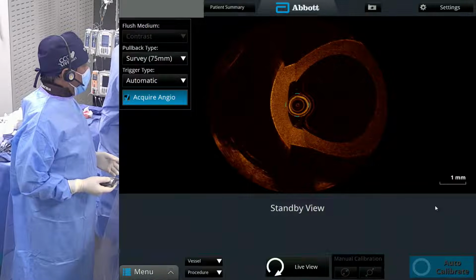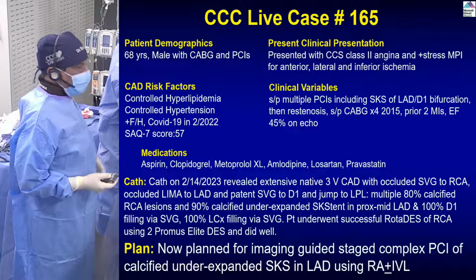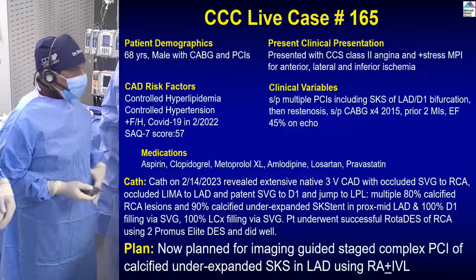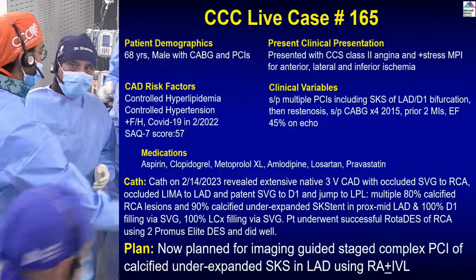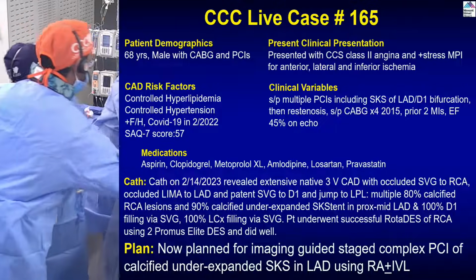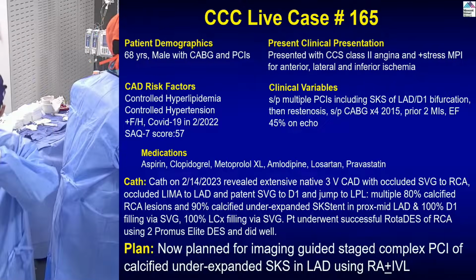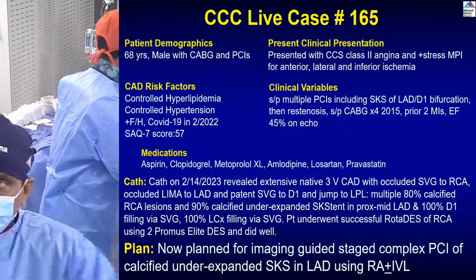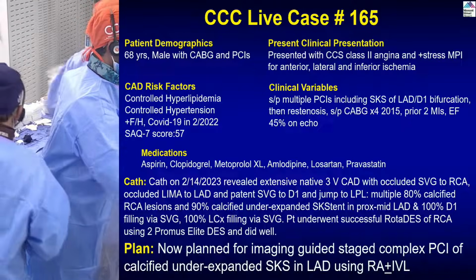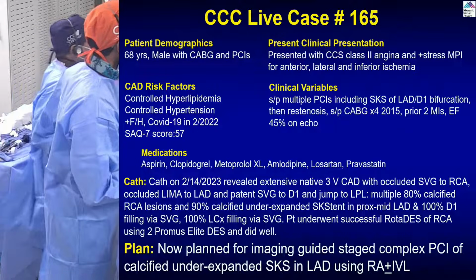Yeah, we can play. Let's put the IVUS on. We can show that old IVUS. Is Elena there? So get the IVUS of last time on 214. Anyway, now we can put OCT on the disc. Go and try to put the IVUS on 214. We'll show it in this case. We are ready for the OCT soon.